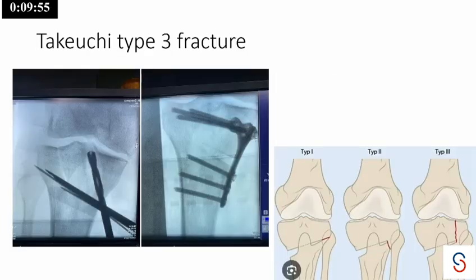Chirag, I think Mukesh wants to make a point before you proceed. Chirag, we all know that artificial bone will resorb, and in such cases, why not use simple autograft? You can use an autograft, no problem. I'm happy using allografts for all my HTOs. For HTOs fine, but here, if it gets resorbed, your tunnel will again widen and your graft will again have issues.